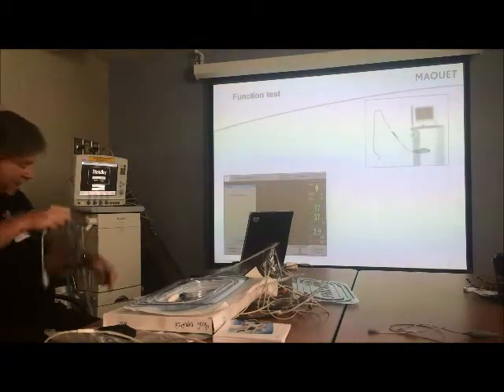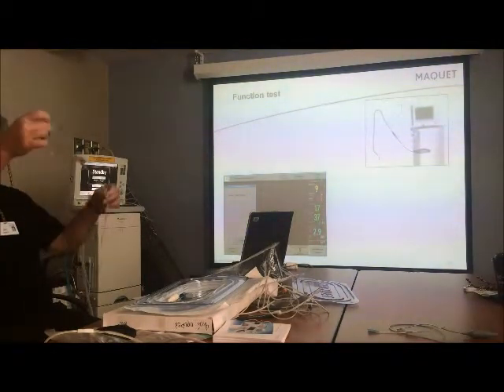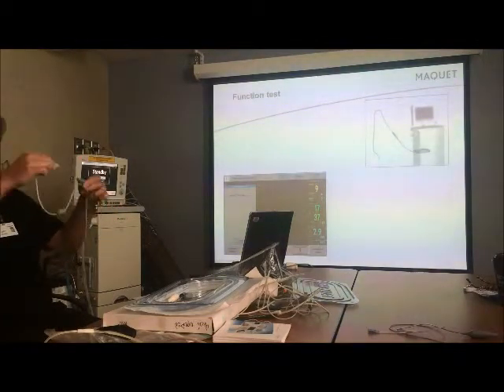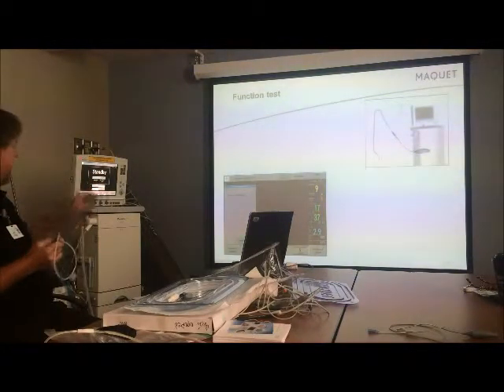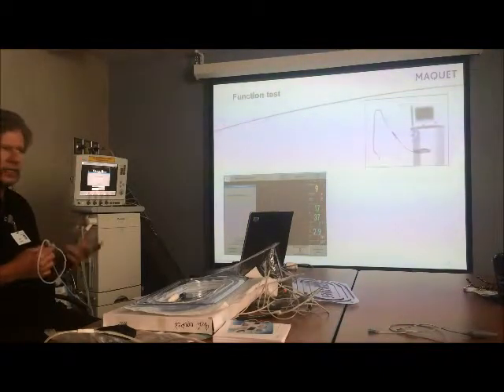To do that, on each one of the cables, you're going to see this thing that I call the doohickey. The doohickey looks like this on the cable, and it's a cap, and it's really the test plug, so you just disconnect the plug, and then it slides on the cable. You take the end of the cable and plug it into the test plug and turn it until it drops in there. When you do that, even if you're running, you're going to get a message on here. It says testing EDI module. Just lasts for a few seconds, and then it says EDI module passed. And that just tests the electrical integrity of the system. It doesn't calibrate it. It doesn't do anything else like that.